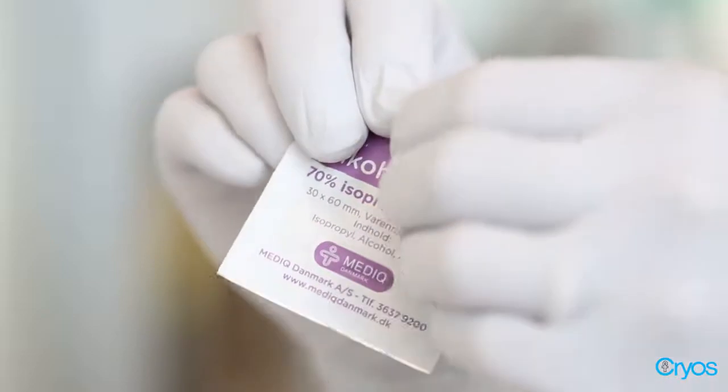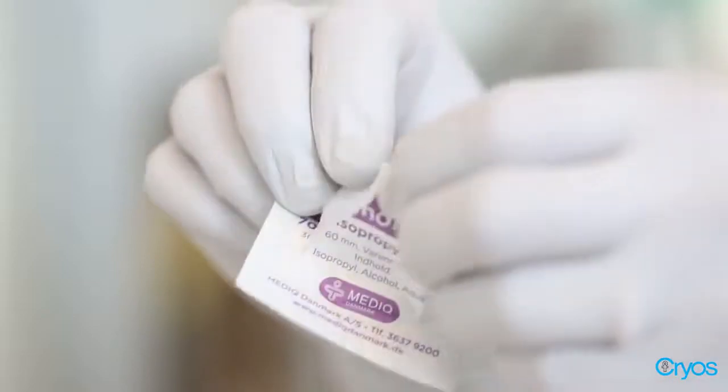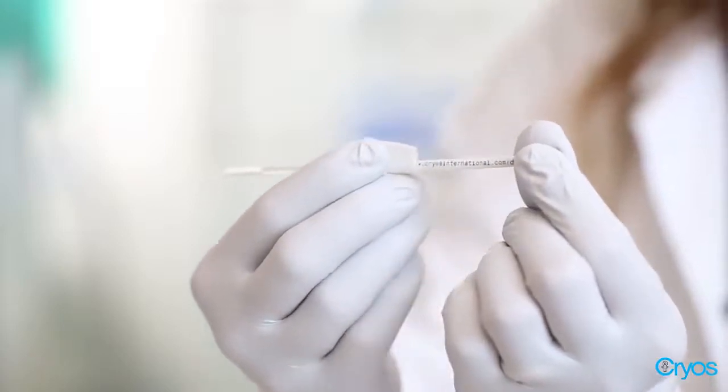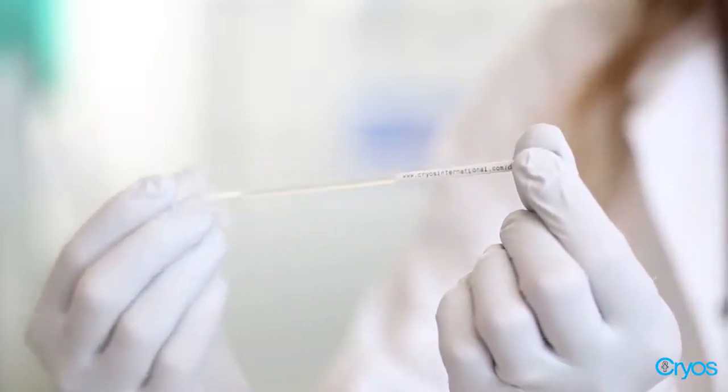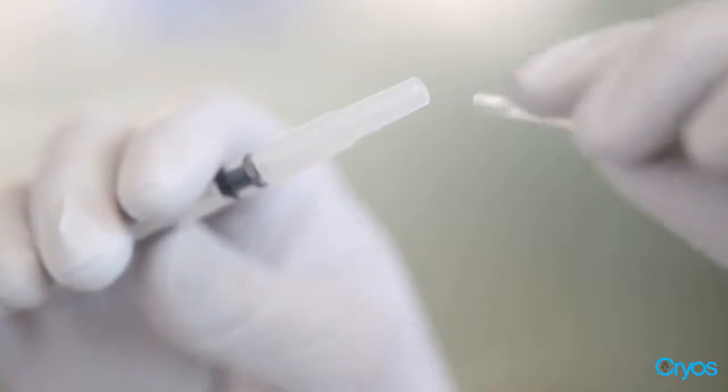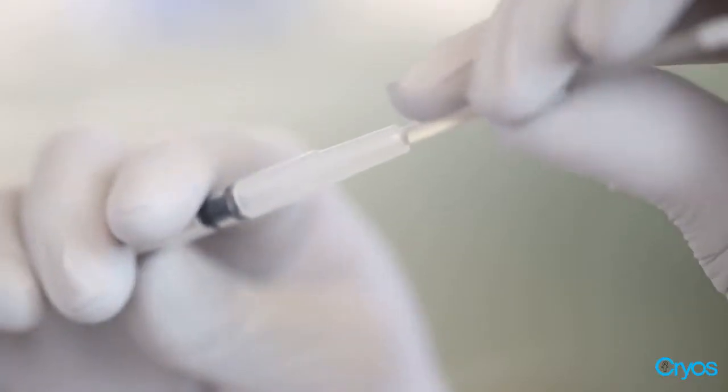After letting the straw sit for 15 to 20 minutes, clean the straw with the alcohol pad by covering the entire surface at least once with the pad. There's an ID number or name on one end of the straw. Identify it. On the opposite end of the straw, use a pair of scissors to cut the seal end. Place the now open cut end into the thin side of the adapter.